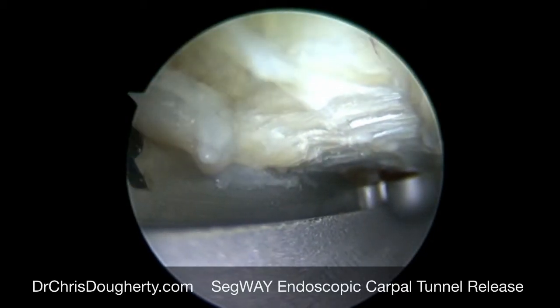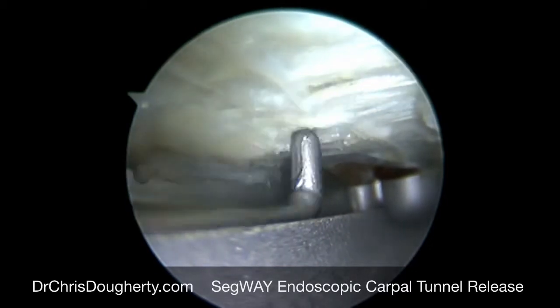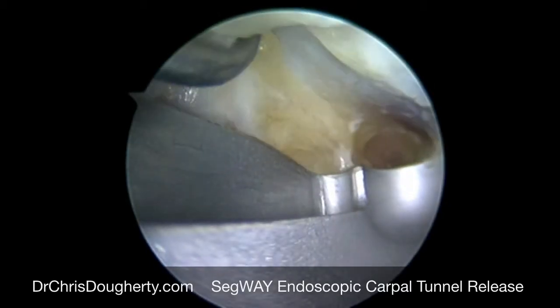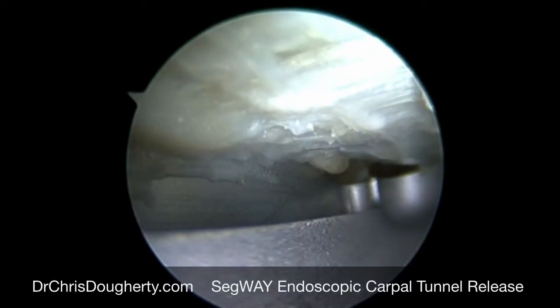Here we're rasping the ligament to clear off the synovium, and you can see the fibers of the ligament itself. Here we probe to the end of the ligament to determine how far we need to bring our knife in to cut the tissue that's binding down onto the nerve.